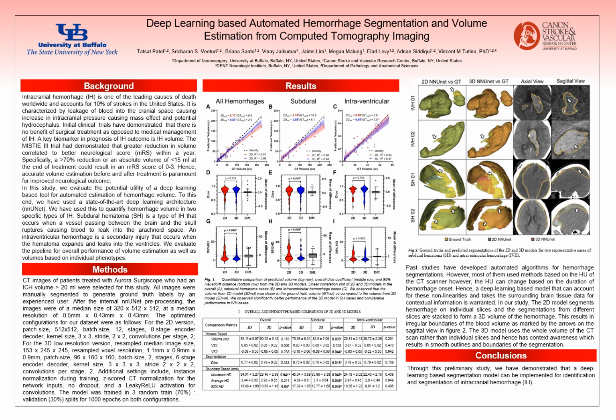So in this particular study, we have tried to use nnU-Net, which is a deep learning framework, to segment the hemorrhage volume from CT images of patients. And we tried to compare two different modalities of this deep learning framework.